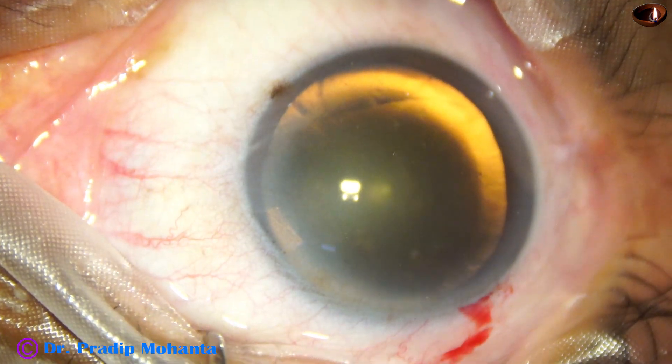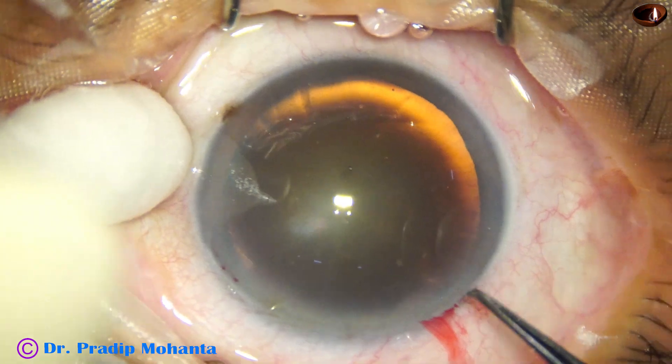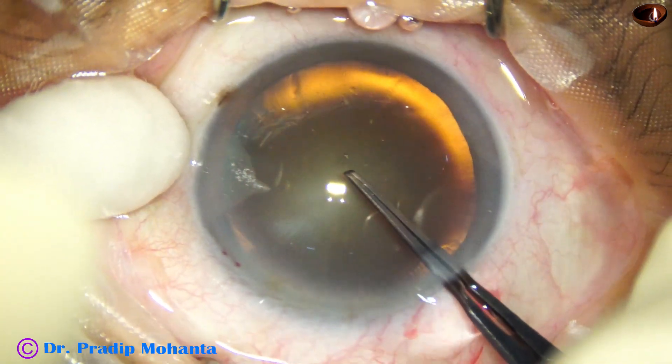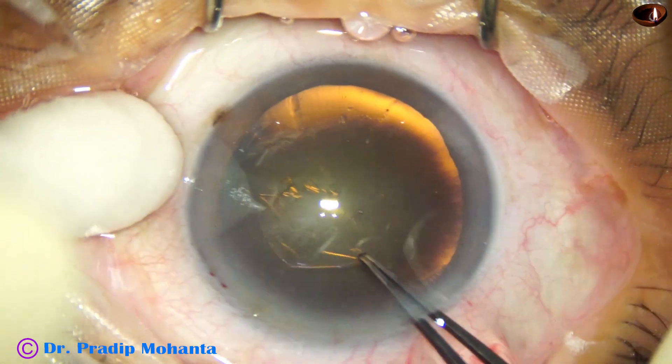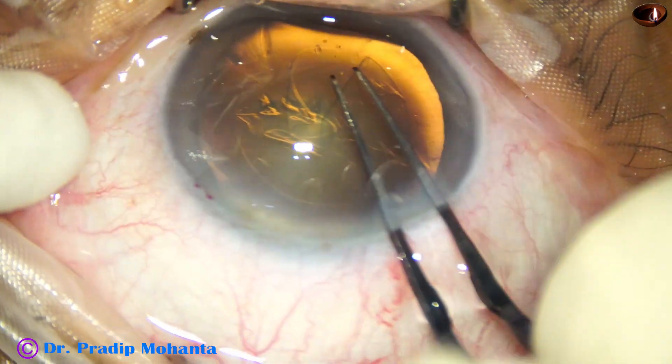Only one side port has been made in this case, meaning my plan is to remove the cortex either by the phaco needle itself or by a Simco cannula or coaxial IA.